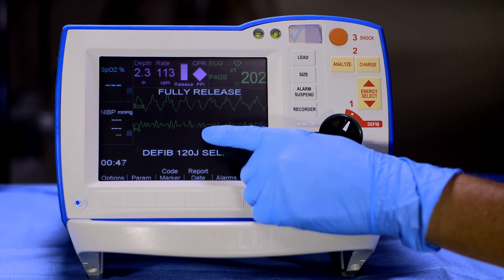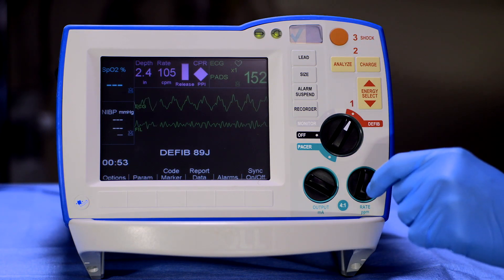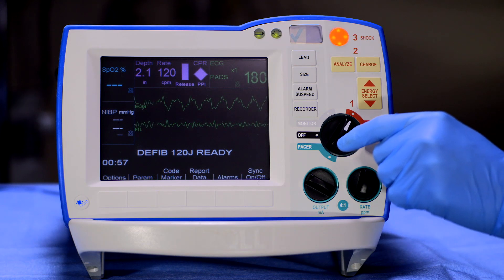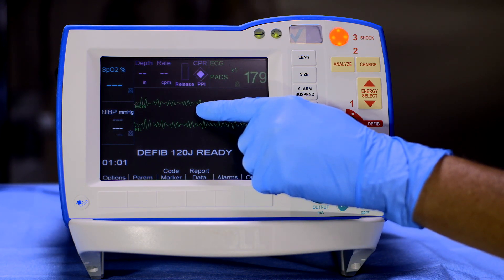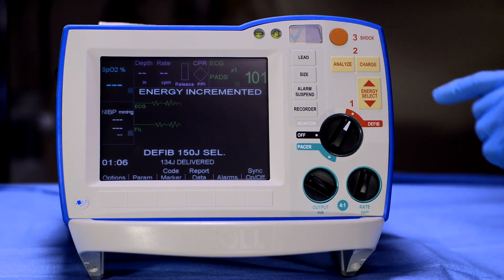If an apparent ventricular fibrillation rhythm is seen while using See-Through CPR, ALS providers should charge the device while continuing compressions. Once the device is fully charged, pause compressions and confirm ventricular fibrillation in the unfiltered ECG waveform. Then press shock.